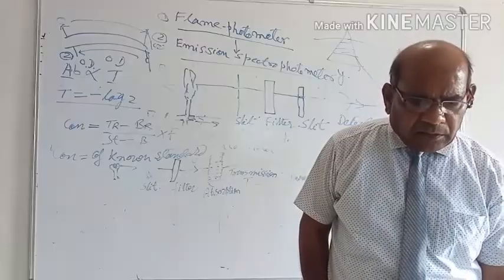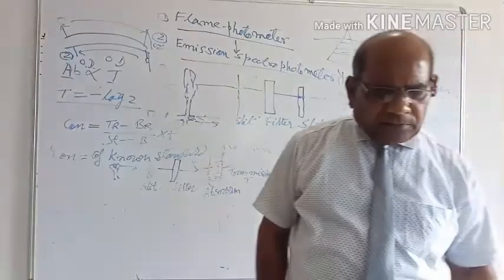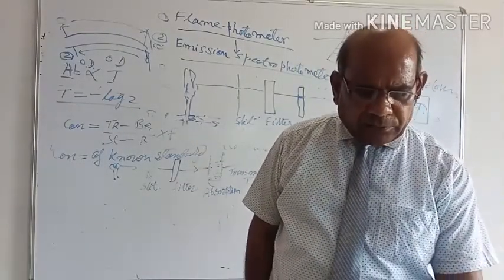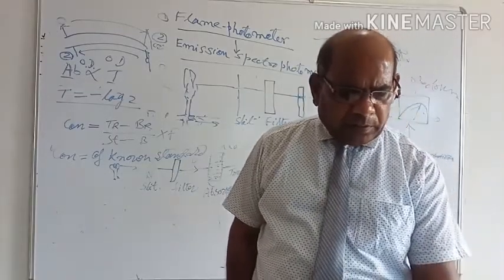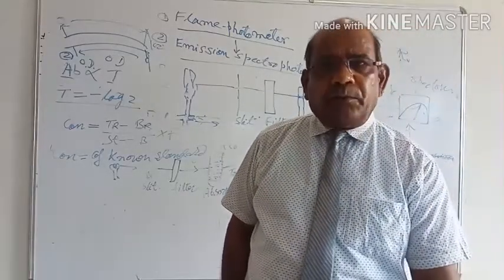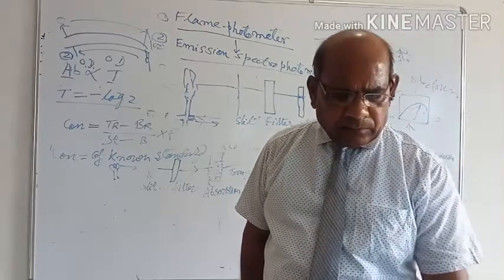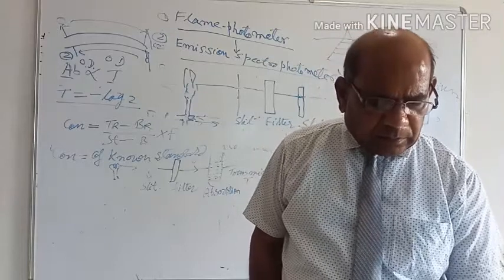In the process, first of all we prepare the dilution of the specimen sample, that is 1 in 200, and we use some internal standard in deionized water.